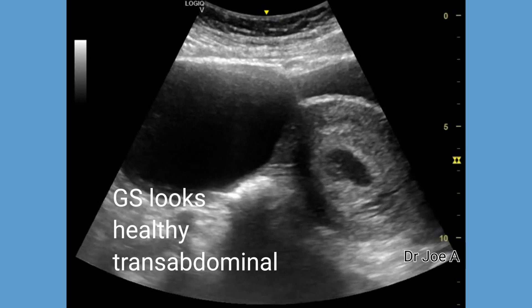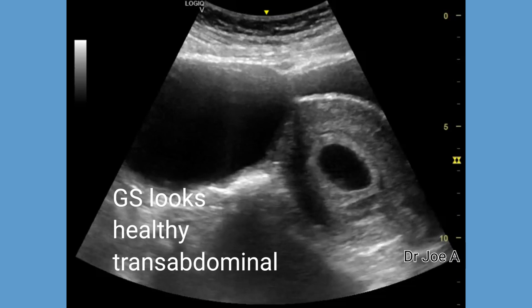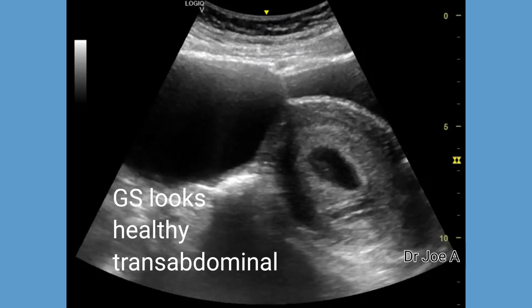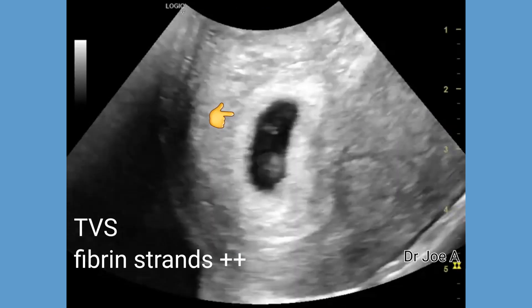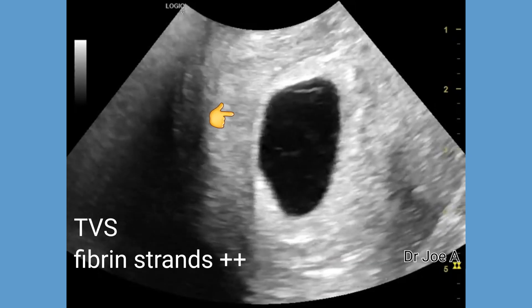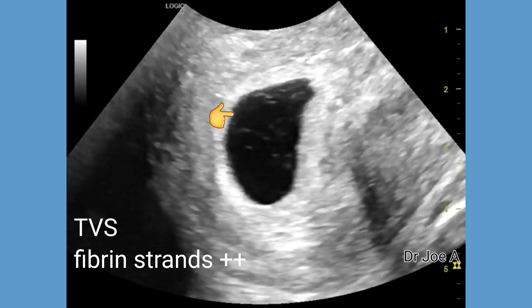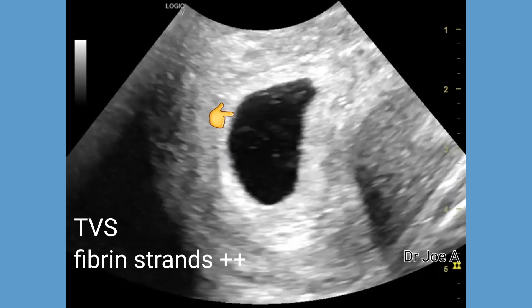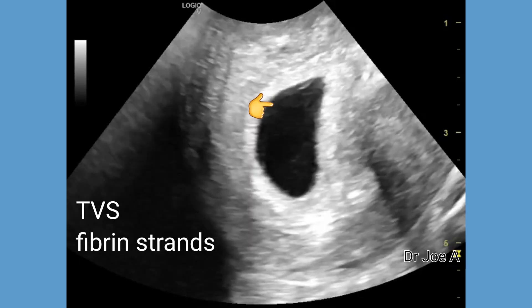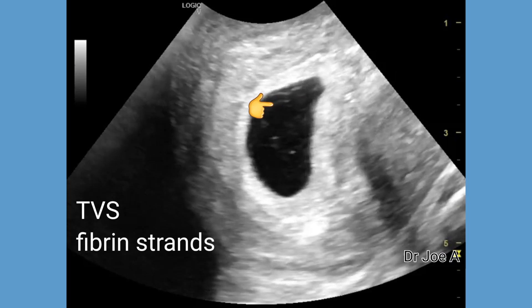We also did a trans-vaginal ultrasound to confirm these findings. Trans-vaginal ultrasound confirms the presence of a viable embryo with a yolk sac also seen. However, the trans-vaginal ultrasound also showed an interesting feature of thin strands within the gestational sac.